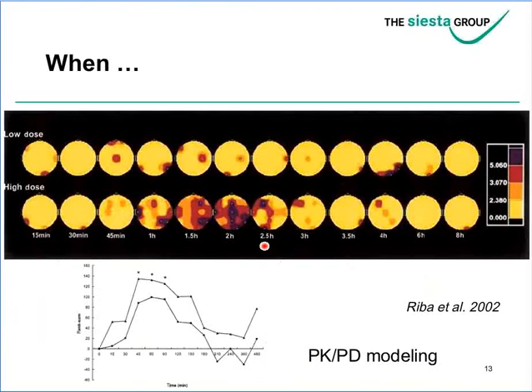electrophysiological measures. Let's talk about the when. This is another important question. Not only does EEG by itself have a very high temporal resolution, it is also a procedure that doesn't take all too long, so it's very easy to repeat it at several time points during the day. Here's an example where you would do EEG measurements at 15, 30, 45, and 60 minutes, and then 1.5, 2, 2.5, 3 hours, and so on after drug dosing.